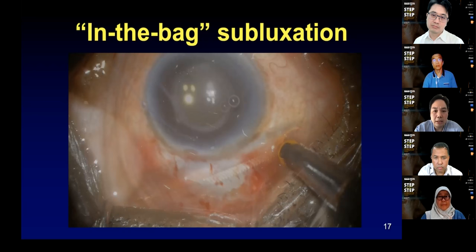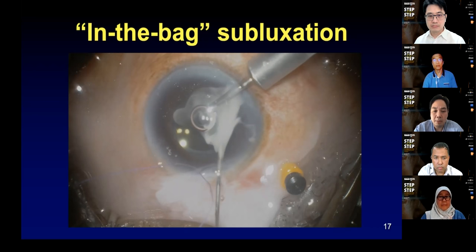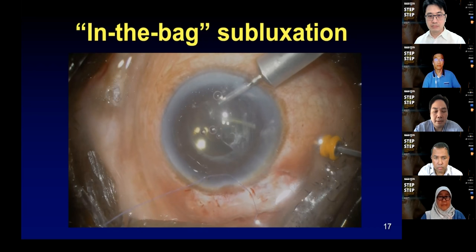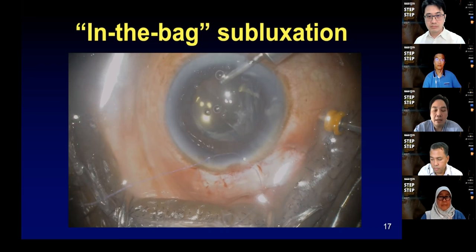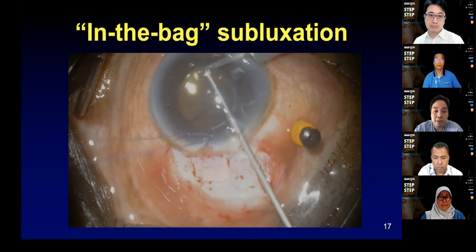Whether you do it pars plana or limbal, pars plana is my preferred approach, with the AC maintainer in place, using triamcinolone to highlight vitreous. Because when you're manipulating either the intraocular lens or sutures, passing needles in that plane, you're going to have vitreous, which you don't want, and you don't want to pull on vitreous and subsequently cause retinal problems. So make sure you clear the vitreous adequately.